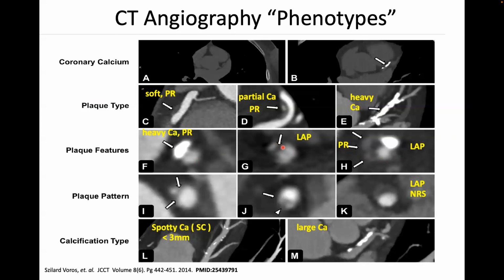It's not even muscle, not basically the arterial wall or inflamed arterial wall. It's less than that. The Hounsfield units are down around minus 150 or something. Then that is fat, probably.